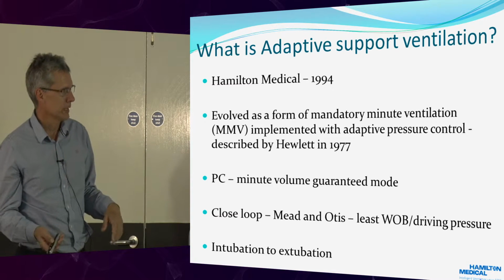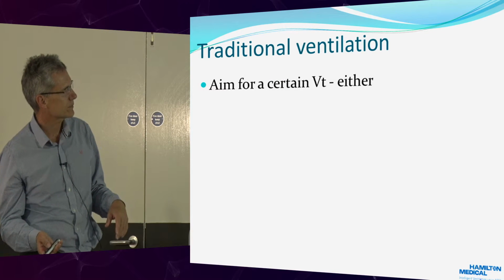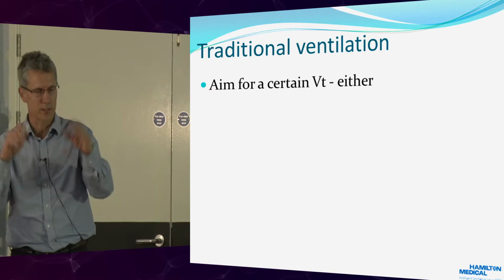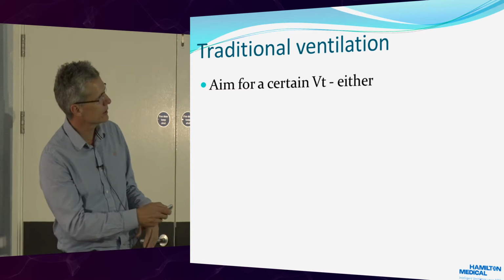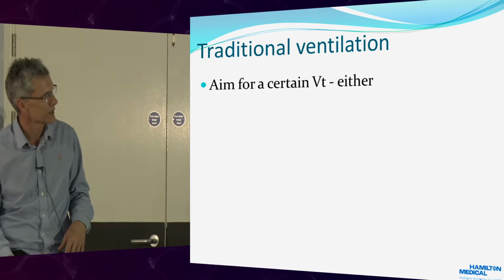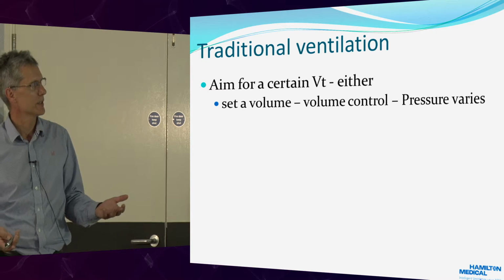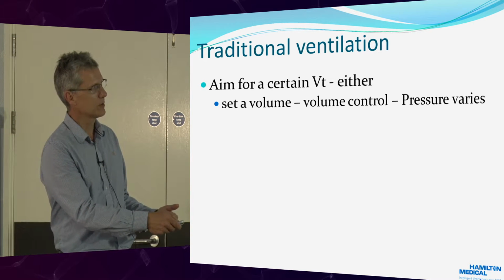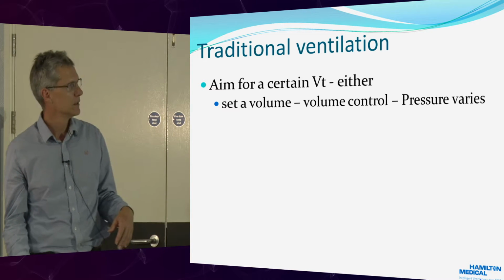And then, yeah, intubation to extubation. So traditional ventilation, and again, you guys will know, I started ICU in '97. We aim for a certain tidal volume, and we'd use a set volume. So if things got better or worse, the pressure would go up or down.